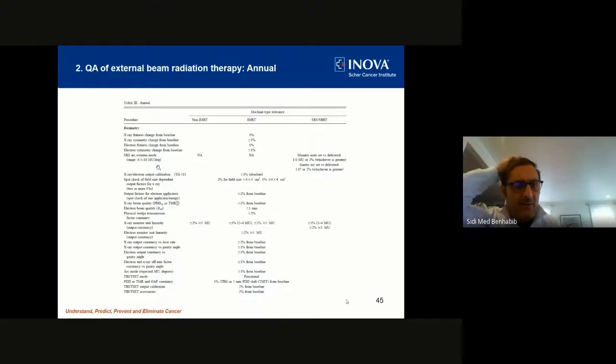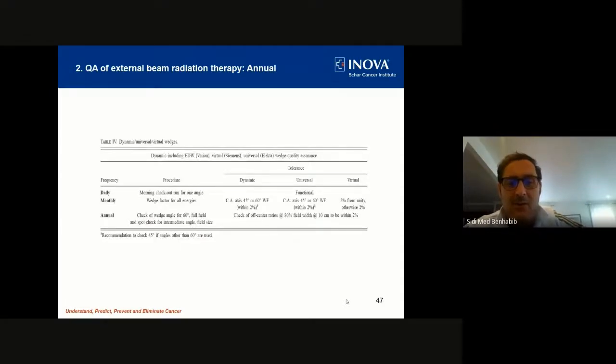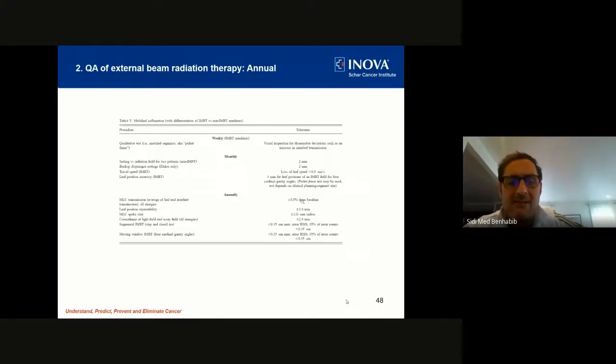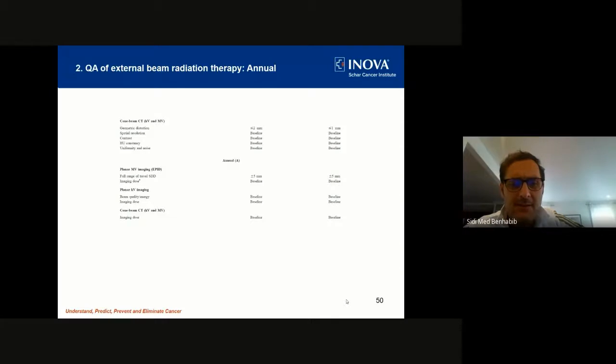This is just for the annual QA, so I'm not going to spend a lot of time here. Next slide. The next slide is more descriptive. Next, this is mechanical and safety. We do also enhanced dynamic wedge. Next. I apologize, I'm going quickly through this, but I'm going to talk about this in the next slides. This is for the multi-leaf collimator, and this is for the OBI. Next slide. This is just for the CBCT and the EPID as well. Next.